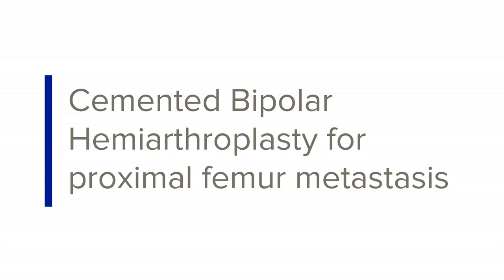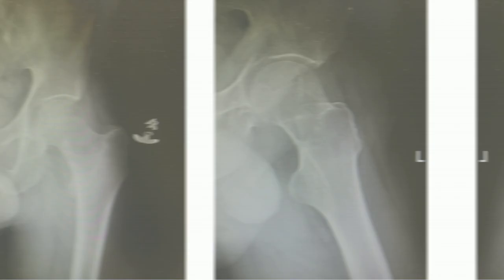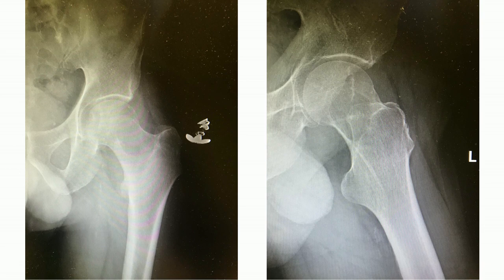The case we're showing you today is a 59-year-old male who has been diagnosed recently of a metastatic bladder urothelial cancer. The x-ray reveals a metastatic lytic lesion at the femoral neck with high risk of pathological fracture with a MIRELS score of 12.